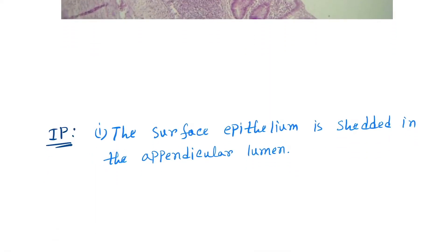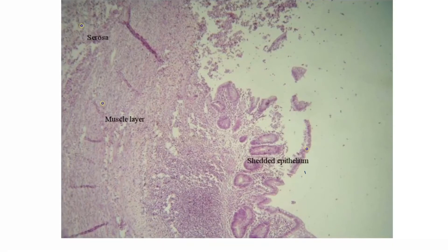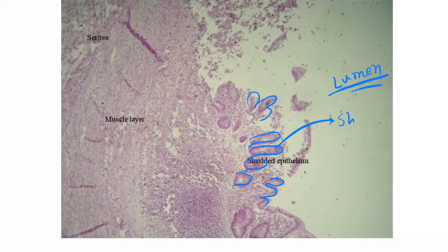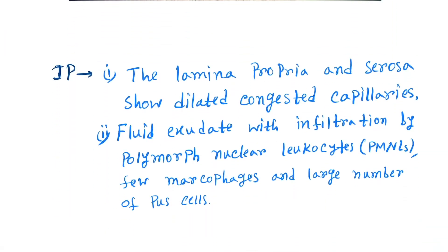The first feature is the surface epithelium is shed into the appendicular lumen. Here is the lumen, and these are the shed epithelial cells — the epithelial layer is no longer organized. This is the shed epithelium.